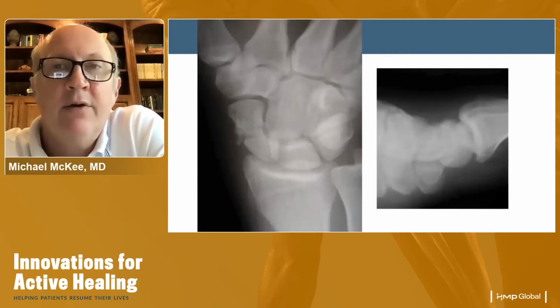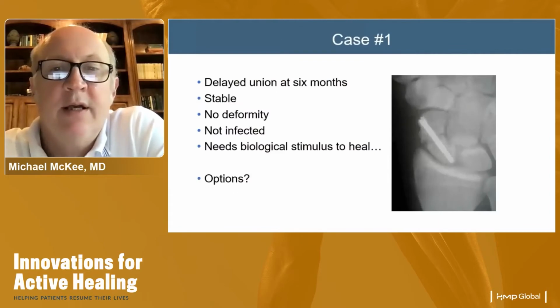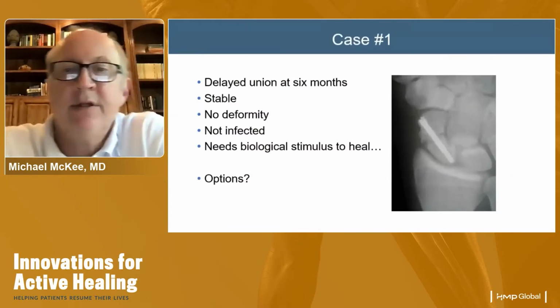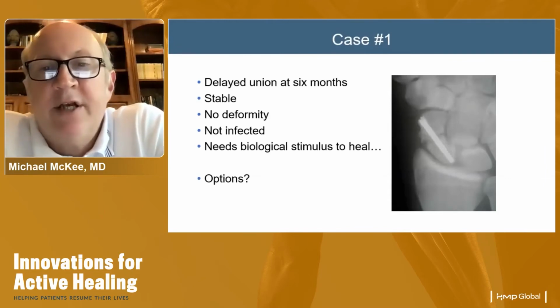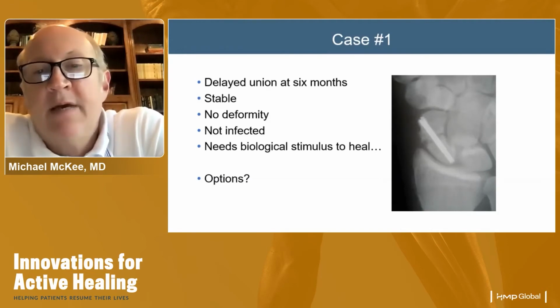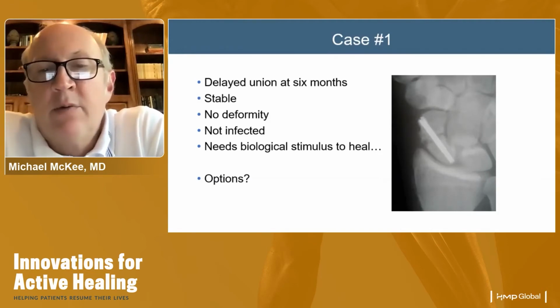And you could argue what ideal treatment for this patient is, but I thought that fixation was definitely indicated. This patient came back at 6 months, and I think we've got pretty good fixation here. You could argue the screw could be a little more vertical in the distal pole, but there's pretty good alignment in the proximal pole, which has been shown to relate to outcome. There was no deformity. The patient wasn't particularly painful, but wanted to get back to doing some heavier things. And I felt awkward letting him do that.